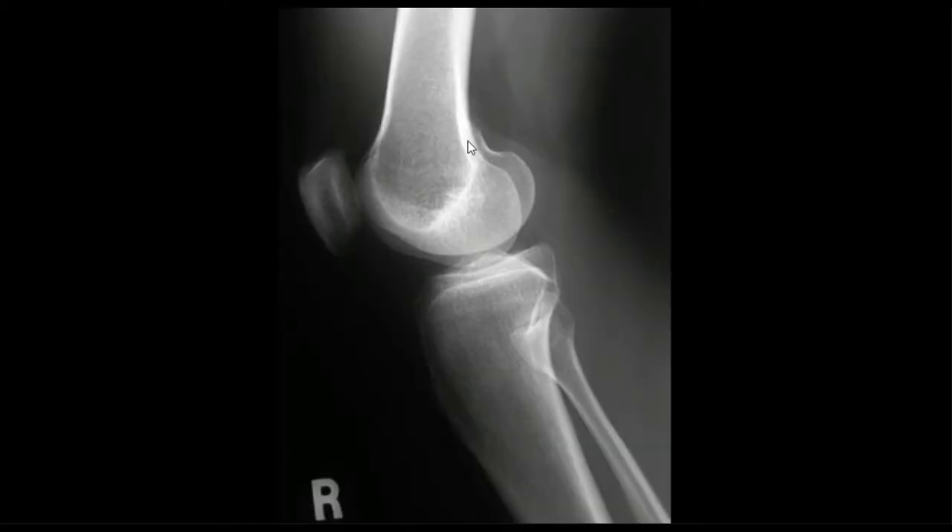This one has a nice adductor tubercle so we can already kind of tell which way this is going to go — here's your medial side. It also has an obvious lateral notch. Now when you have two bumps that look like they could be lateral notches, it's always going to be the one that comes first. This one's a little too far anterior on the condyle — it's going to be this one here that's a little bit closer to the bottom and is flatter. We know this also because here's our adductor tubercle, which means this is the medial side, rounder, so this is going to be our lateral side with the little lateral notch there.